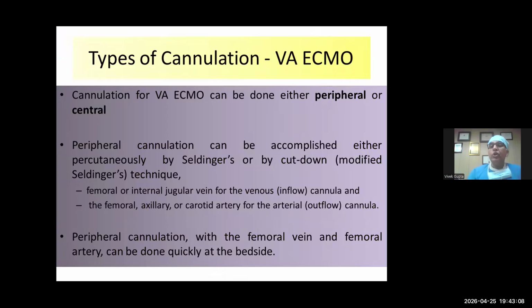So how do we initiate that? This is important: we must understand that when we are going to integrate a machine with a human being, we have to have something in between, and this is what the cannula is. We do the cannulation, and we take out the blood from the major vein, the femoral vein most commonly in the ICU setup, and we return back the blood.